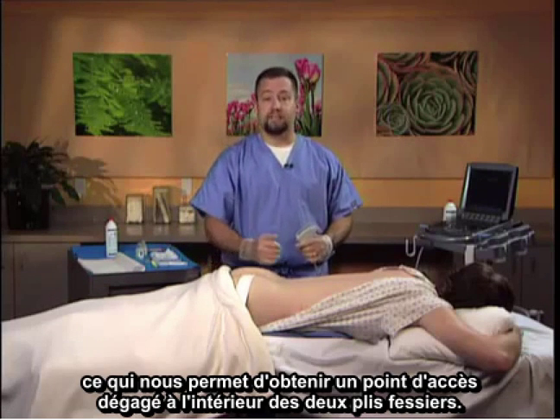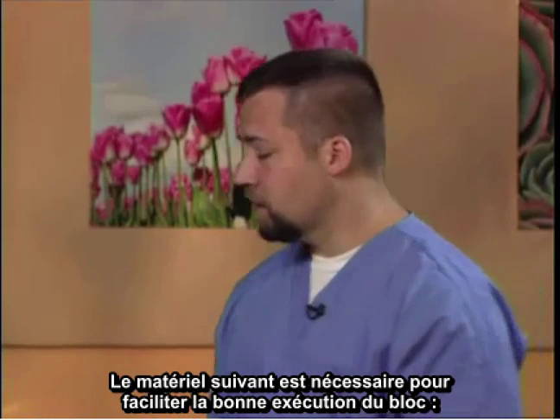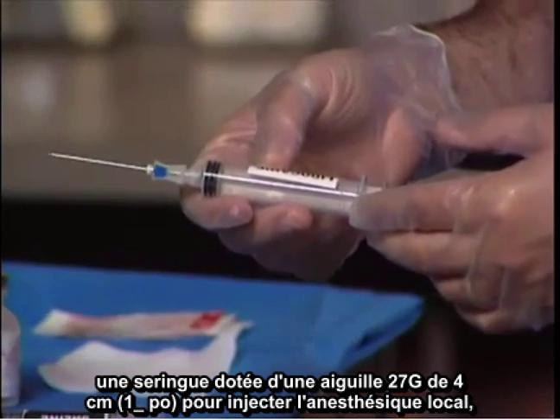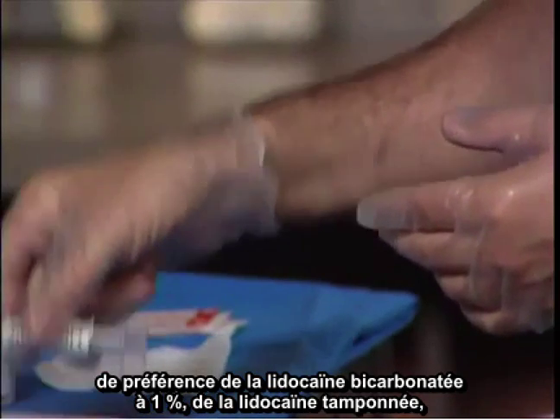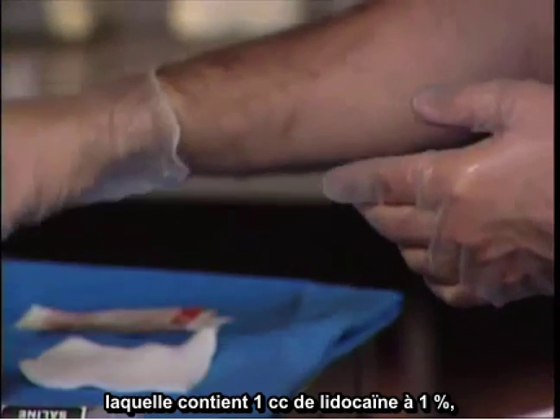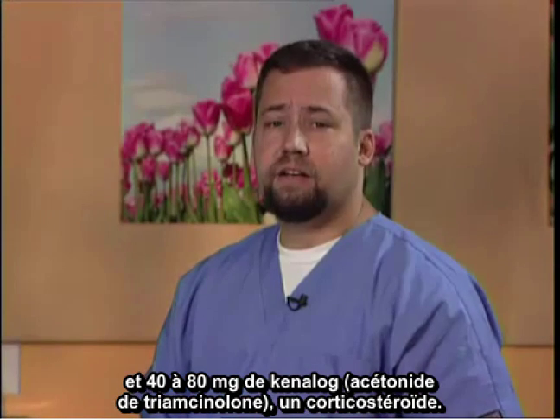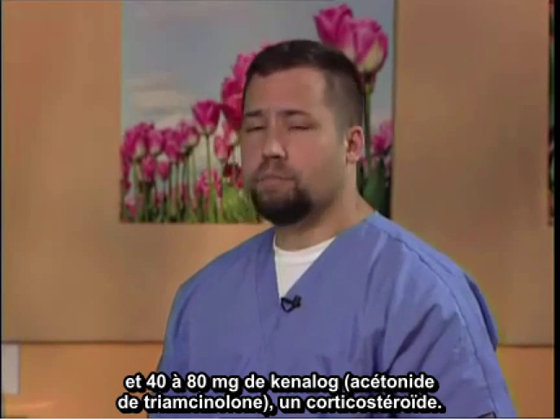We now have a clean access point within the two gluteal folds. In order to facilitate a proper block, the following equipment is required: a chlorhexidine prep for sterile technique; a local anesthetic syringe with a 27 gauge, one and a half inch needle for local anesthetic placement, preferably one percent bicarbonated buffered lidocaine; and a syringe containing the epidural steroid mix, which is composed of one percent one cc lidocaine, six cc's of bacteriostatic saline, and 40 to 80 milligrams of triamcinolone (Kenalog), which is a particulate steroid.